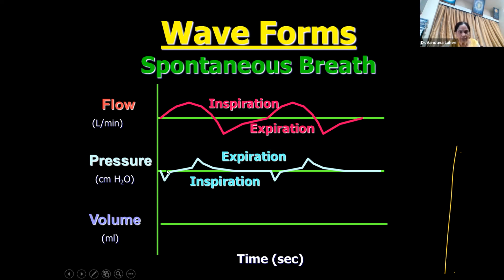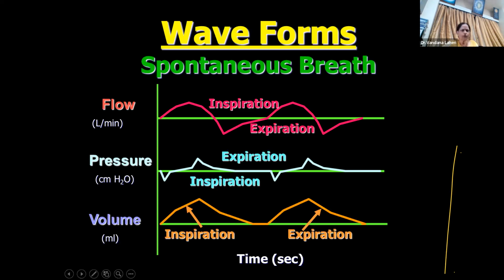Then the pressure comes to the positive side. This is expiration. So the negative side shows the inspiratory phase, and everything on the positive side of the y-axis is expiration. Volume curves are very simple. This is inspiration, this is expiration. There is not much to be learned from volume, except how much volume the patient is receiving, whether volume is lost, and all that you can make out from the curves.